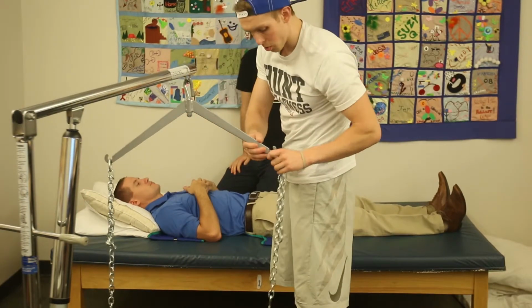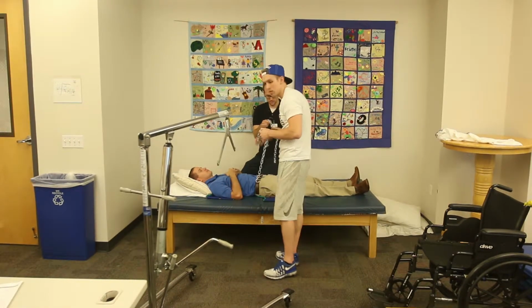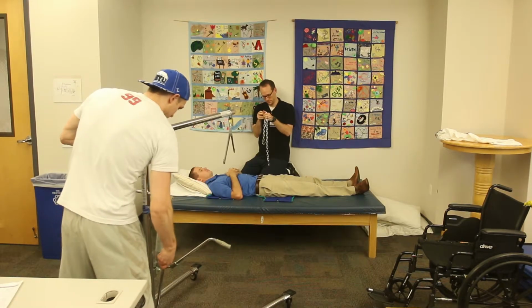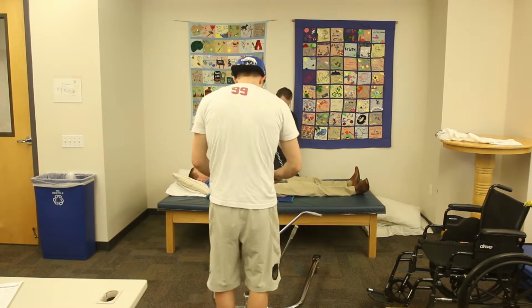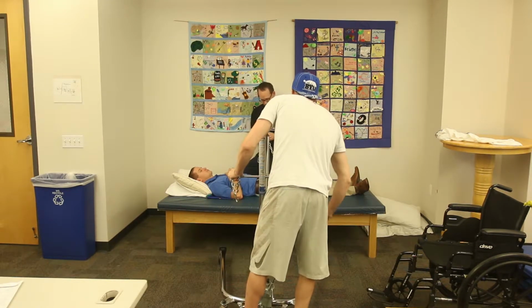So the next thing we're going to do is we're going to hook up the lift to that sling. So I'll hand Lucas these chains. I'm going to get the lift set up here. Make sure we're unlocked there for now. We're going to pump this up so we're not going to hit you with it as we come in.